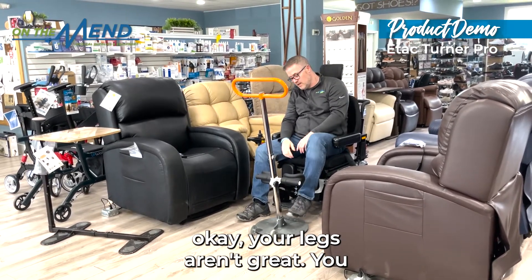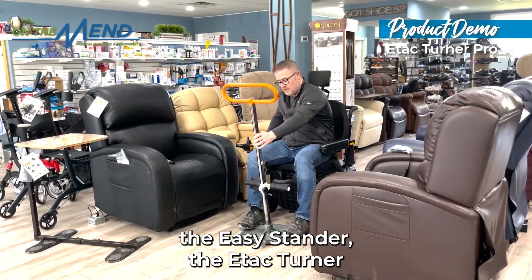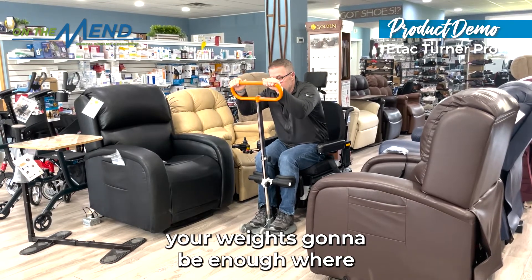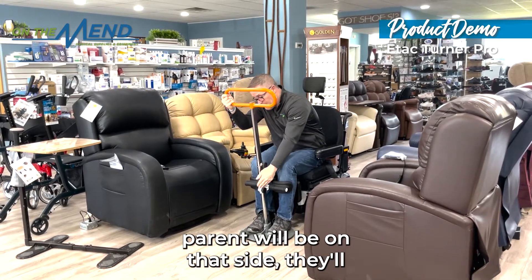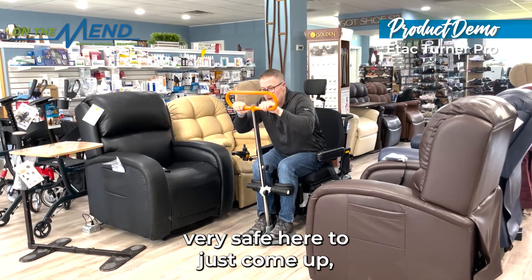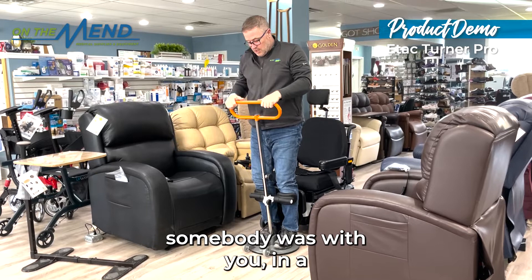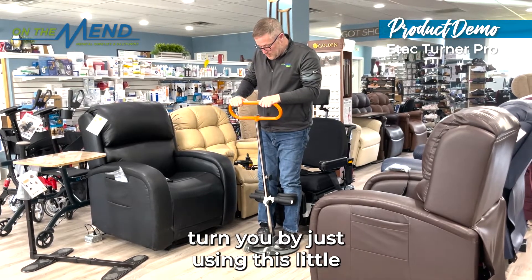At this point, your legs aren't great. You bring in the E-Tac Turner stander with your own weight. You're going to use it, be secure — your weight's going to be enough where you can take this. Normally a caregiver or loved one will be on that side using the step, but it's also very safe to just come up and use your power to get yourself up. And if somebody was with you, they can turn you by using this little device.